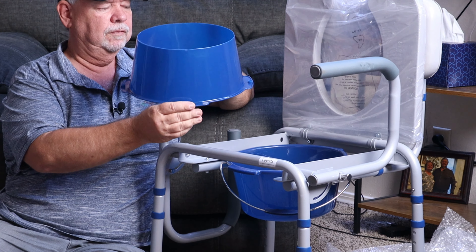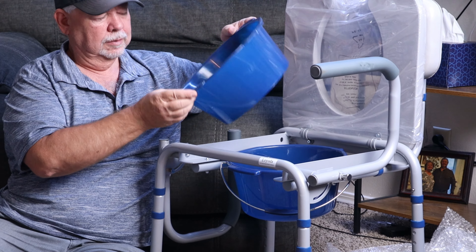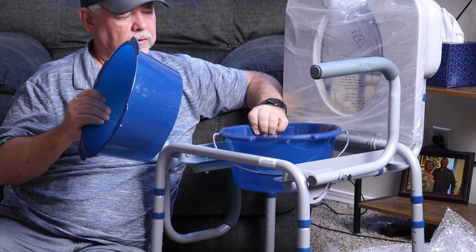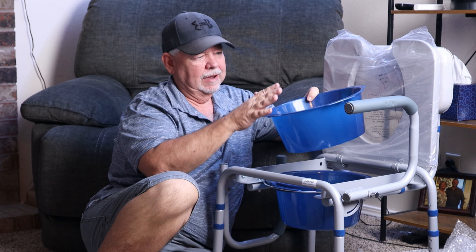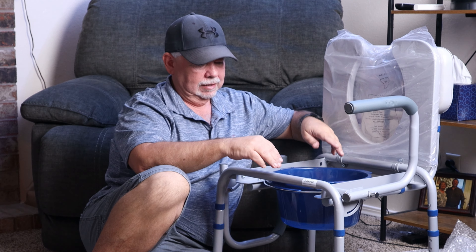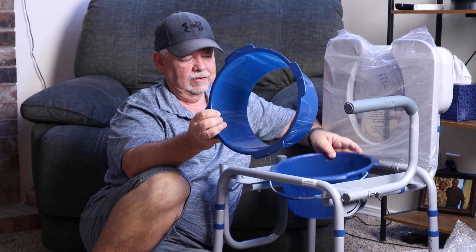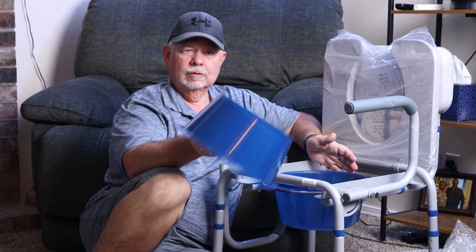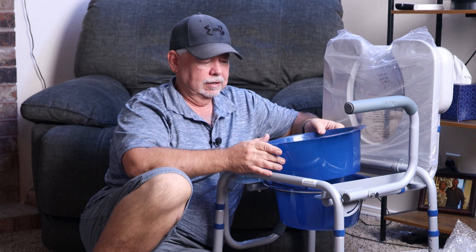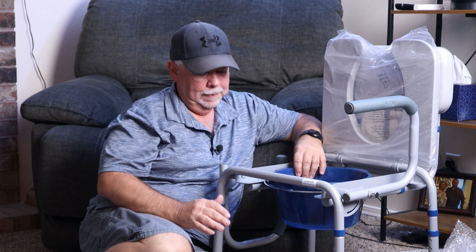This does have holes in each one of these lips that stick out right here. I'm not real sure what those are for. It may have bags that would fit in here, and then it would lock it into place like that. Then you could lift that, take your bag out of it. This would actually stay clean because you have your bag. I'm just saying that because I know they make bags for camping that you put your waste in, shall we say. But anyway, there it is.